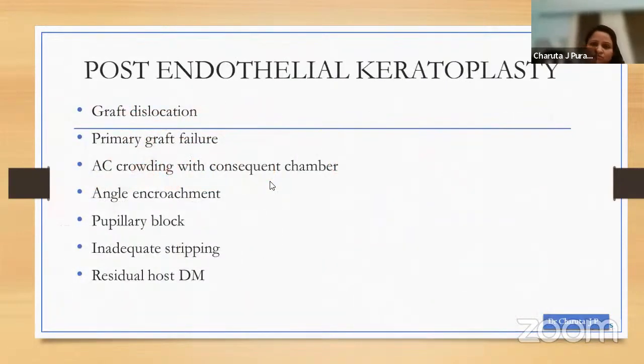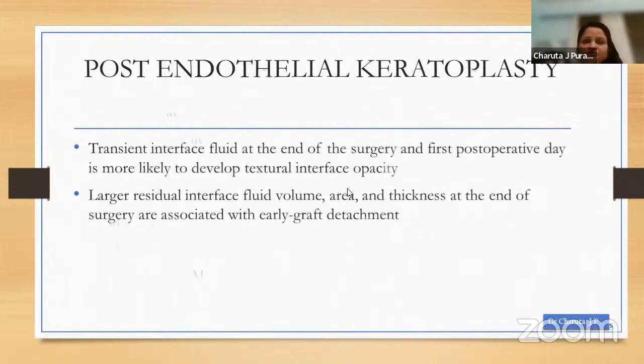Now, post-endothelial keratoplasty, again, it's invaluable to diagnose graft dislocation, also to detect primary graft failure, crowding of the anterior chamber in case of thick grafts, encroachment of angles in secondary glaucoma cases, pupillary blocks, and also to detect inadequate stripping and the residual host DM.